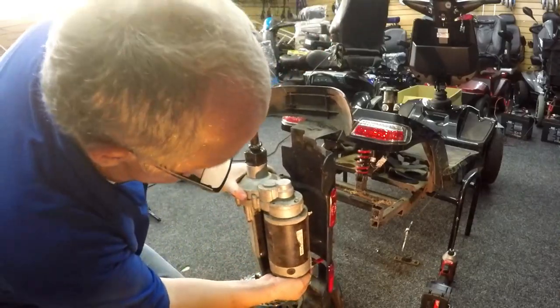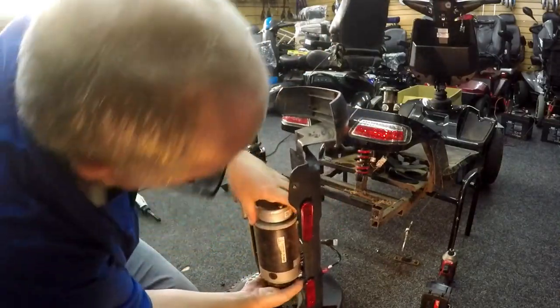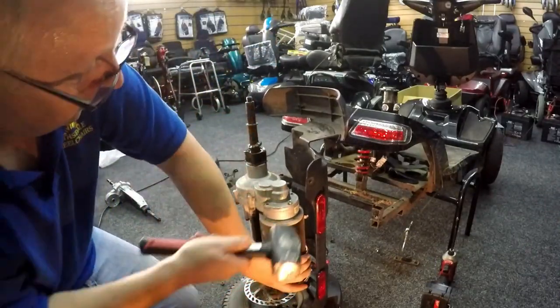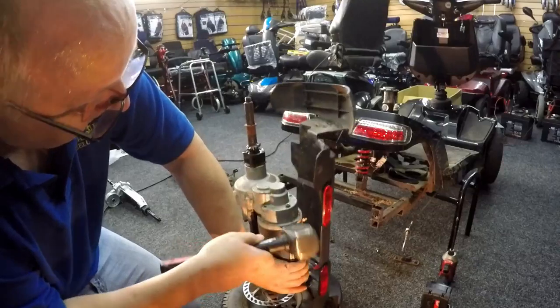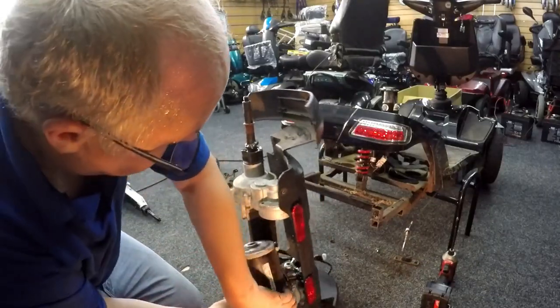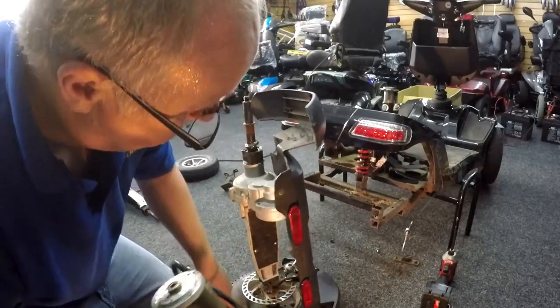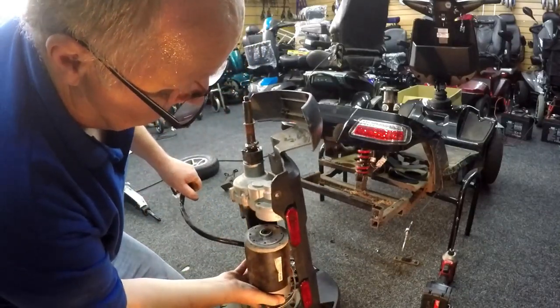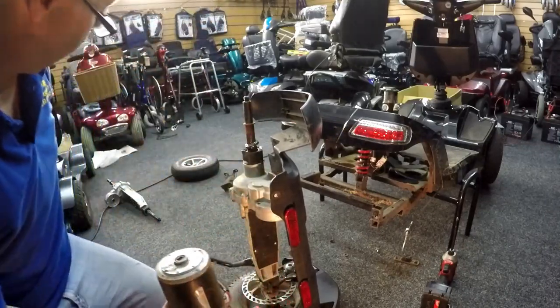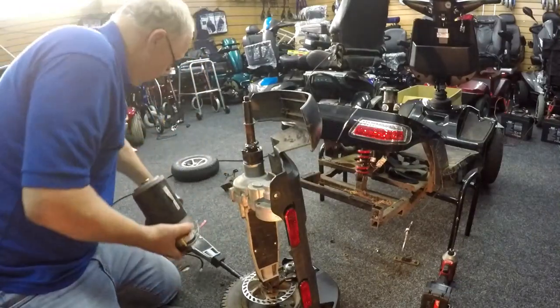Now that should come off. Let's give it a wee go. There you go, that's her off. So of course when you take it off you want to remember how you took it off. These 2 outside bolts go in here. So it goes on like that.